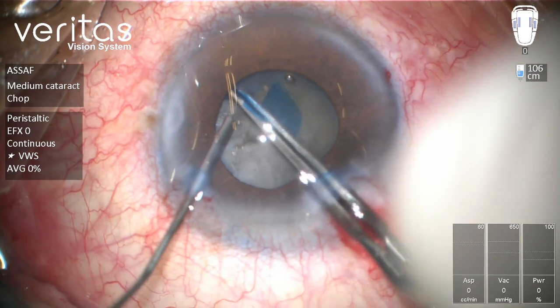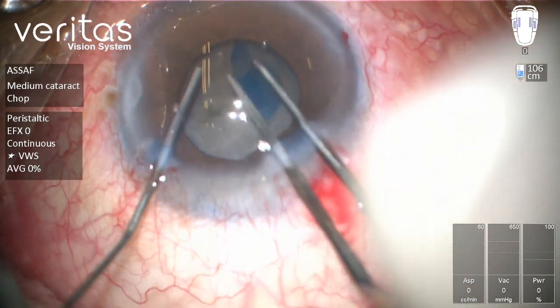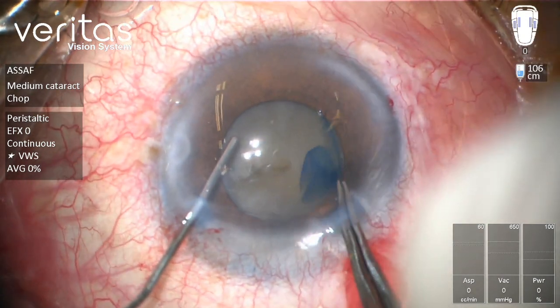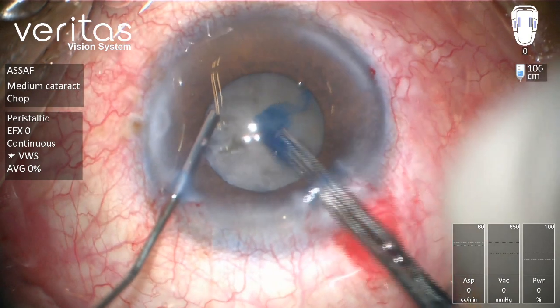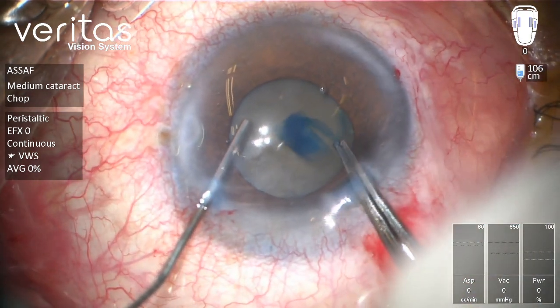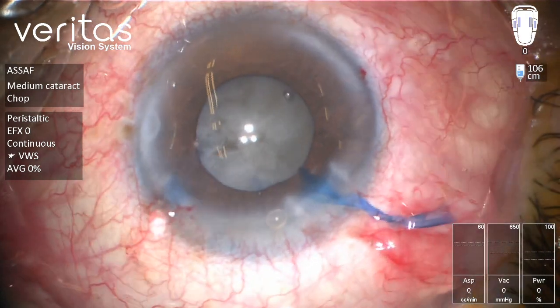It's really important to have good control of the direction of the tear during capsulorhexis; otherwise it might escape behind the iris and you lose control. Now we have a reasonable rhexis around 5 millimeters in diameter.